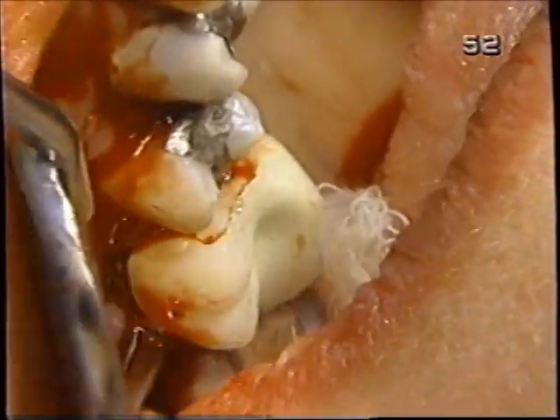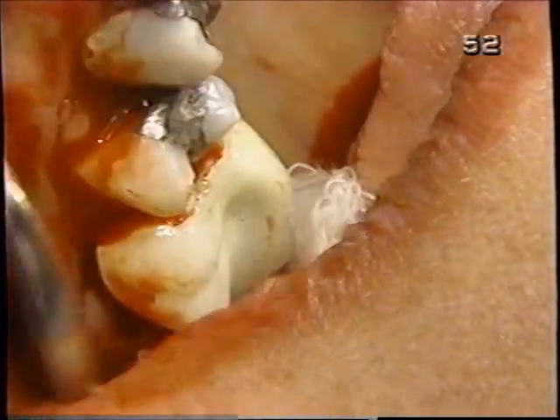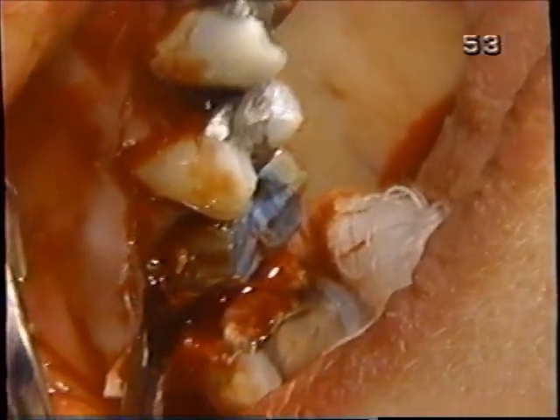Would you take this crown that's coming off? Right there. As we would expect that it would.